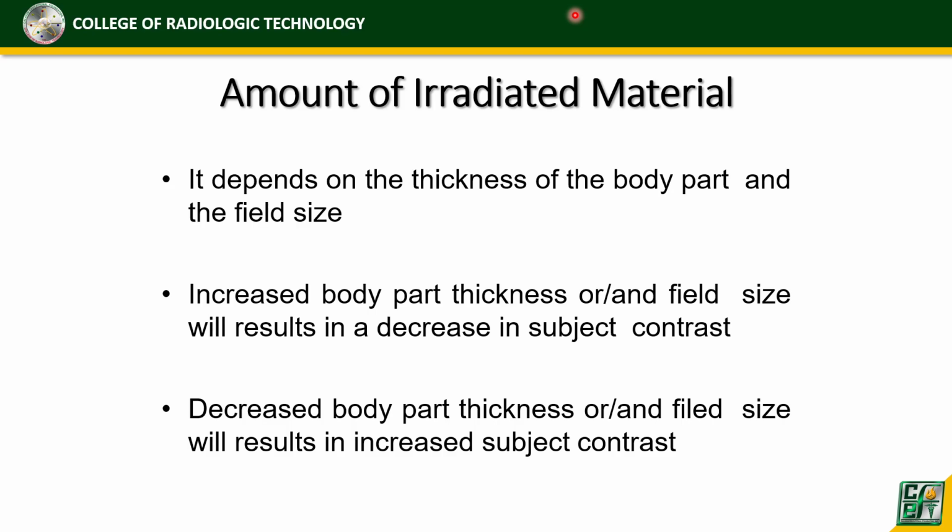So that means body thickness and field size are inversely proportional with subject contrast. Okay?